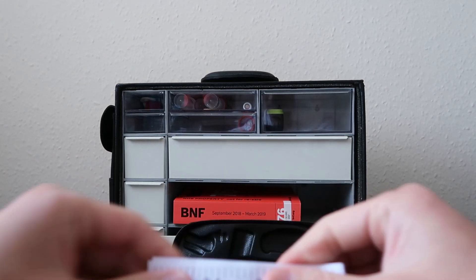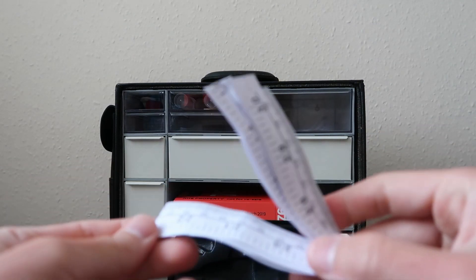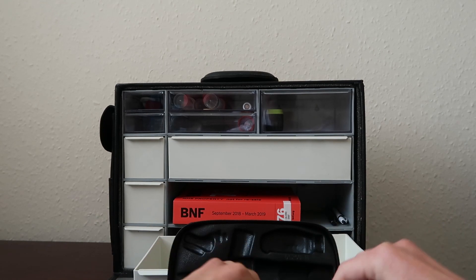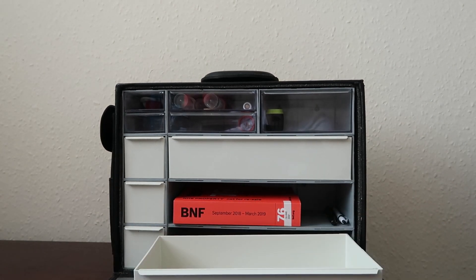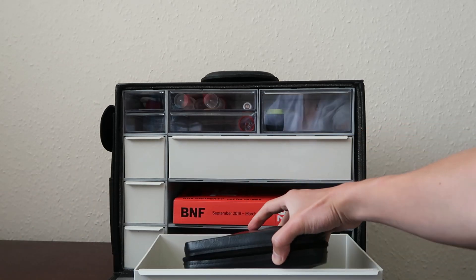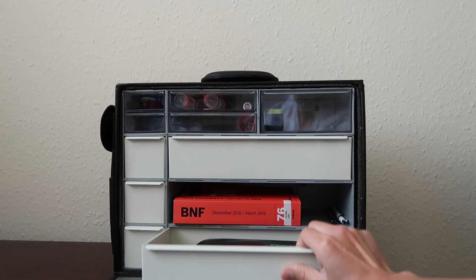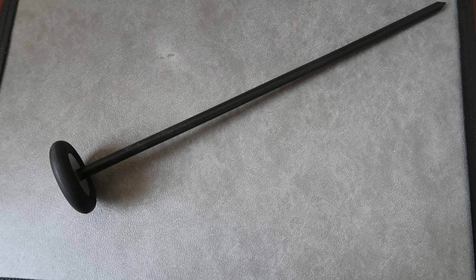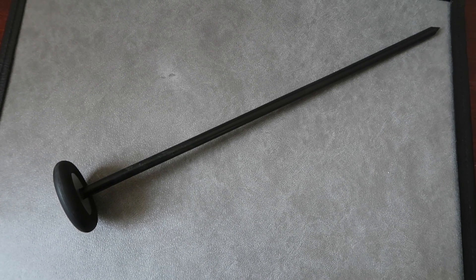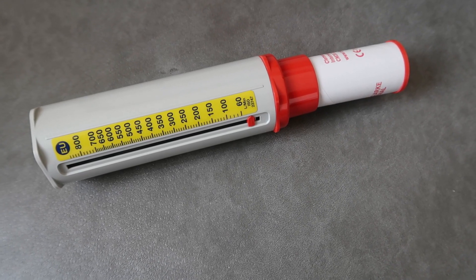I usually carry a tape measure just in case I need to measure a length or circumference. A tendon hammer is also important, especially if you're carrying out a neurological exam. And then a peak flow meter.